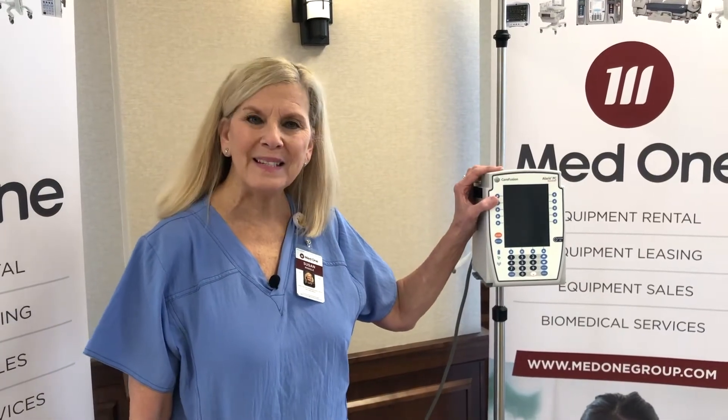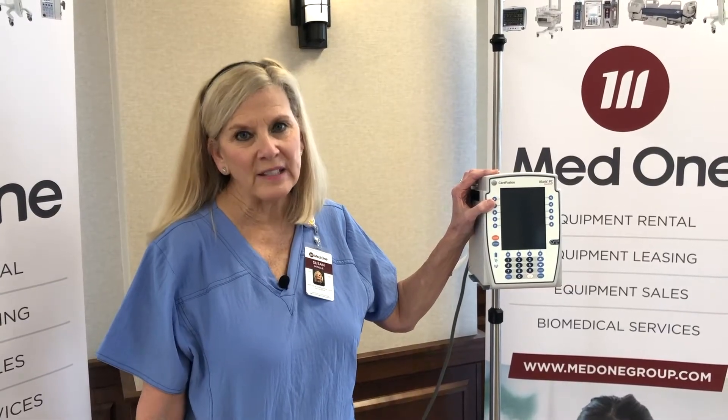Hi, my name is Susan Mingle. I'm a clinical nurse educator with MedOne Group and I'm here today to do a training session on the Alaris point-of-care unit and the syringe pump module that you've recently acquired for use. I'd like to start with an overview of what we call the Alaris PCU point-of-care unit, sometimes referred to as the brain. Nurses like to call it that because without this nothing else works.